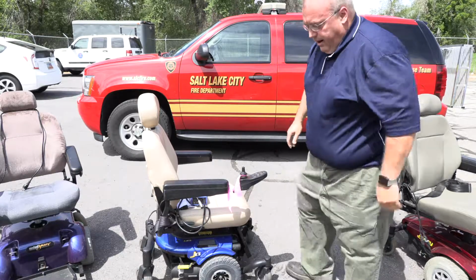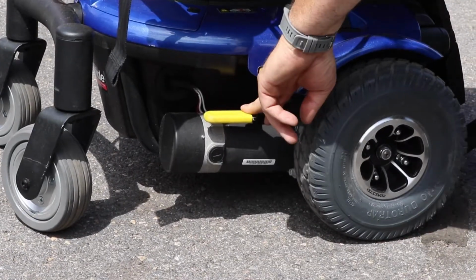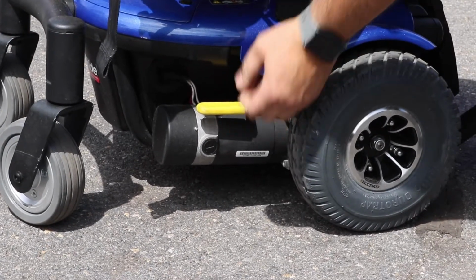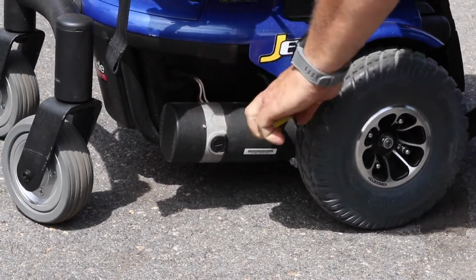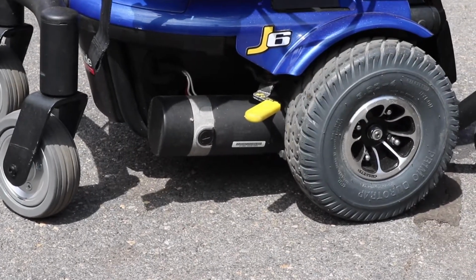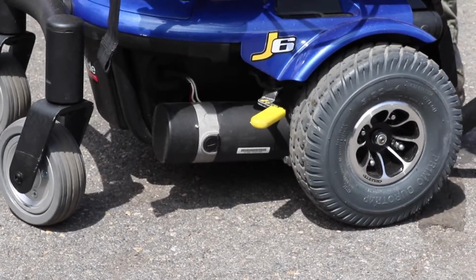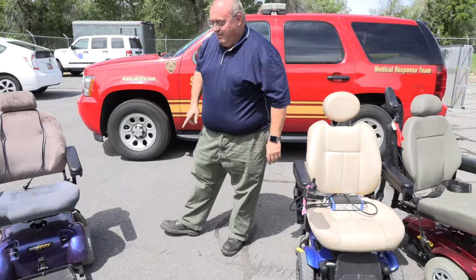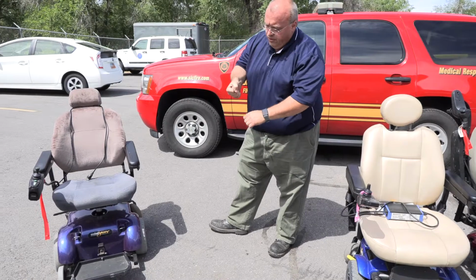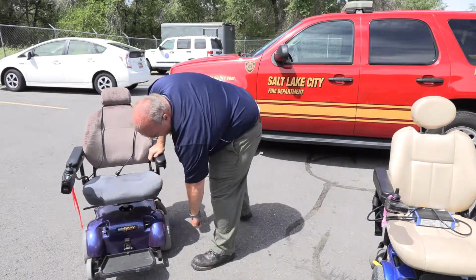Okay, this is another quite common chair here. They did us all a favor by making these, instead of going up and down, you grab these yellow levers and pull them out. There's even a little diagram. Sometimes, you'll see a lot of different chairs and a lot of different conditions. Don't expect to necessarily see a diagram. Very similar to the motor I showed you earlier, there's just a simple L-shaped pin that goes directly into the gearbox.